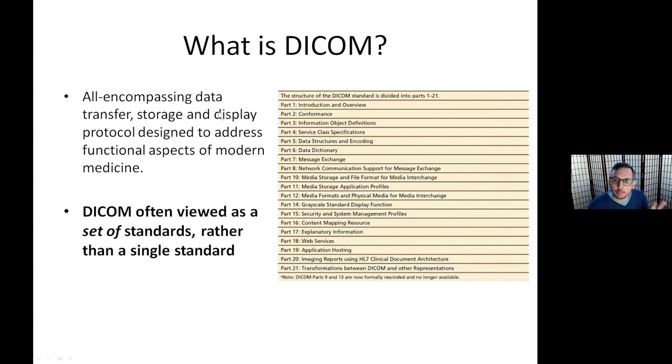It's an all-encompassing standard, so much so that some people refer to it as a set of standards rather than just a standard. And these are all the different parts of it. I want to draw your attention to part six, the data dictionary. I think this is one of the most important parts. A lot of these other elements are important as well. And this is why, if you're interested in entrepreneurship in this field, this is important to know.